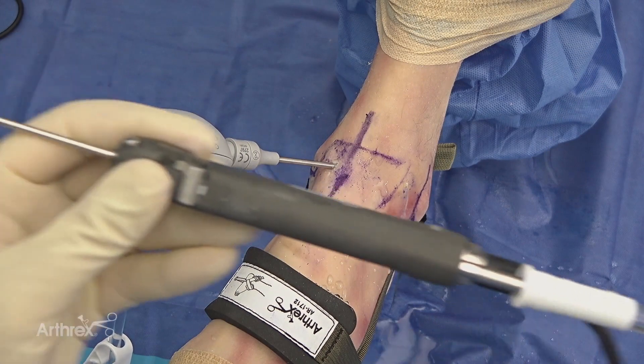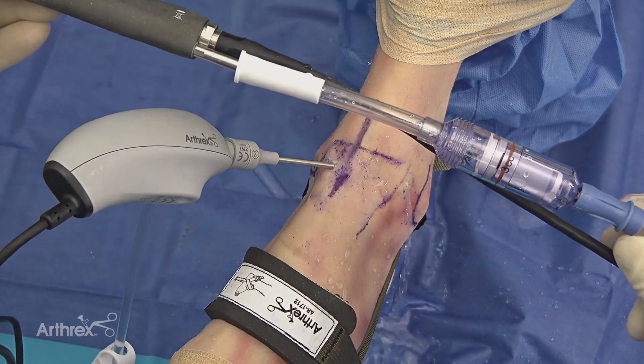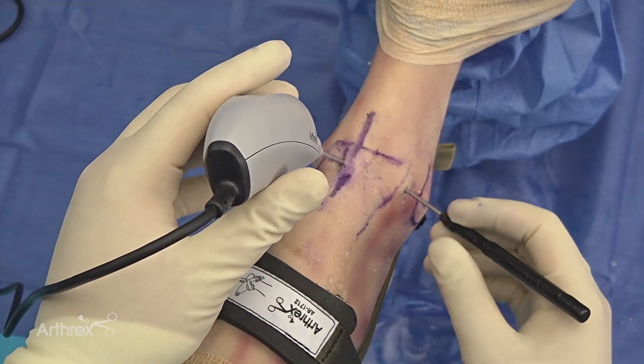When treating an osteochondral defect of the talus, I strongly believe in employing the AutoCart technique. You'll begin by attaching your graft net harvesting tool to the back of your shaver. We'll utilize our nano saber shaver with an 11 centimeter working length to begin harvesting, with the graft net attached to the back of the shaver allowing for excellent cell viability as seen in numerous studies. I like to go back and forth utilizing both my cup curette and ring curette to have nice margins and sharp walls around the rim of the chondral defect.